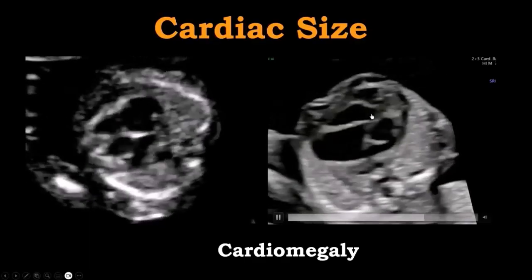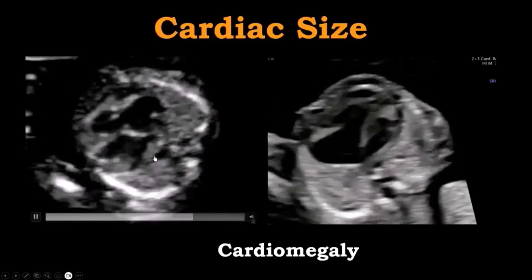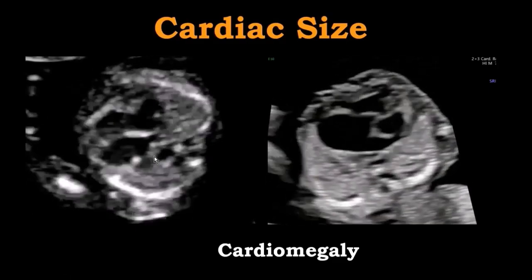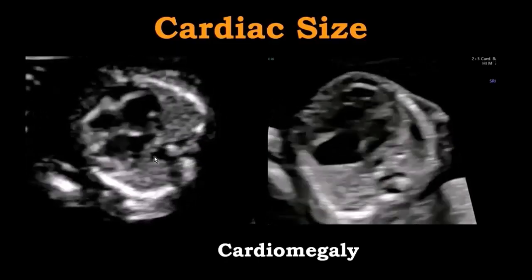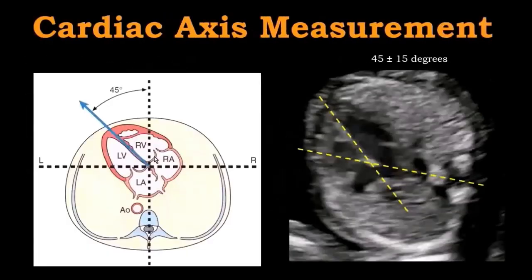So here we deal with the tricuspid dysplasia, and this is the fetus that has the severe pulmonary stenosis that early, as well as the early onset of the twin transfusion closer to 14 and 6 weeks gestation. So that was the recipient twin.